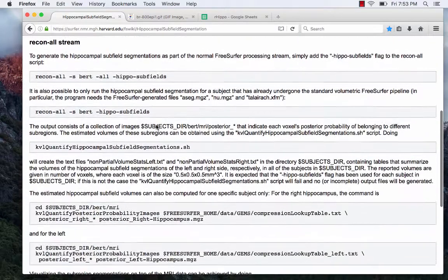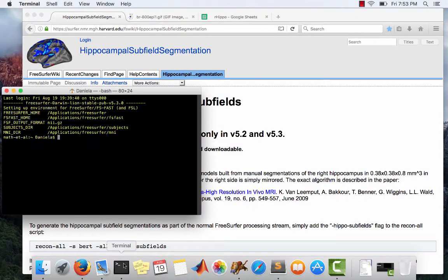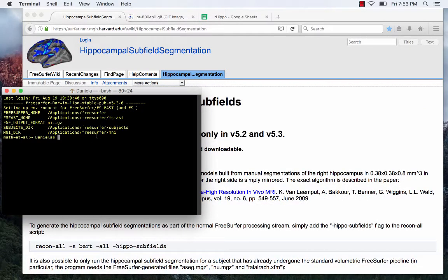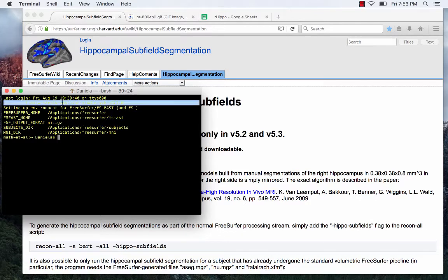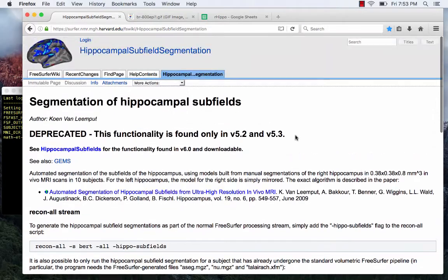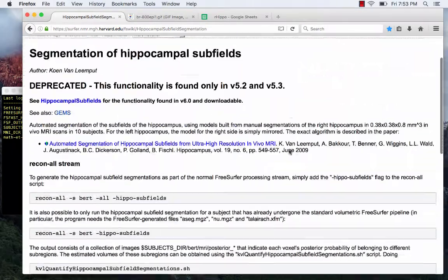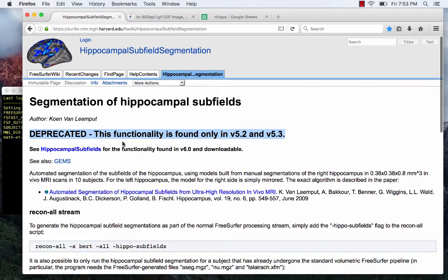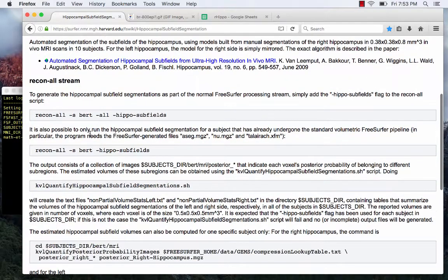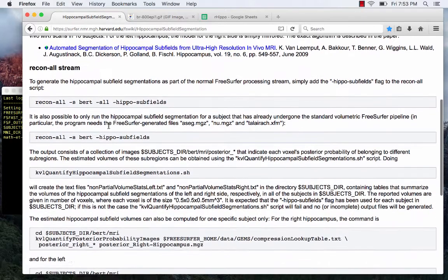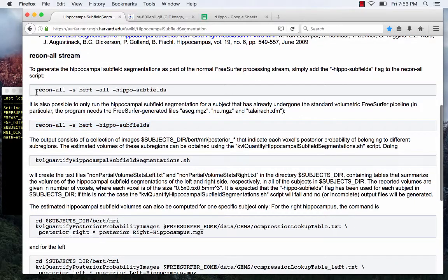So for the 5.3 version: if you have your bash profile set up to run FreeSurfer already, just open a terminal and it will tell you up top that it's version 5.3. If you're using 5.3 and want to follow along, go to the relevant web page — it says it's deprecated, but it still works.